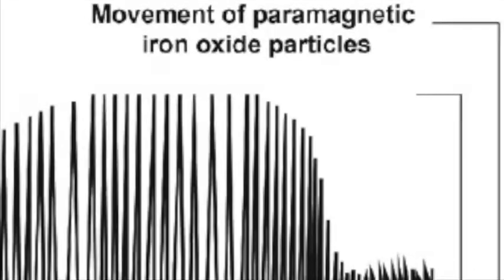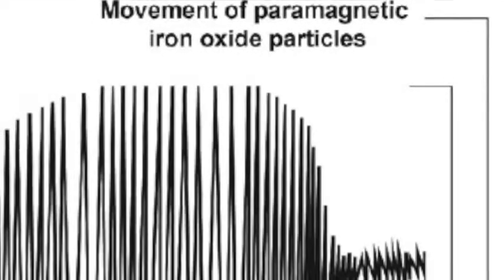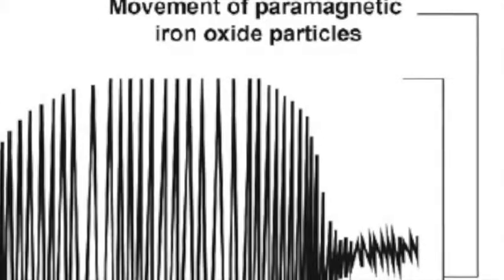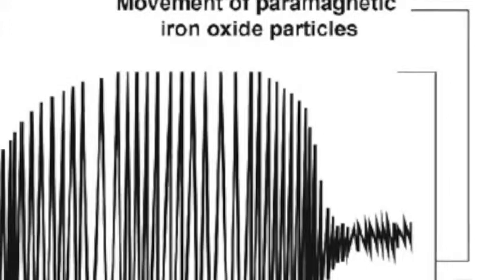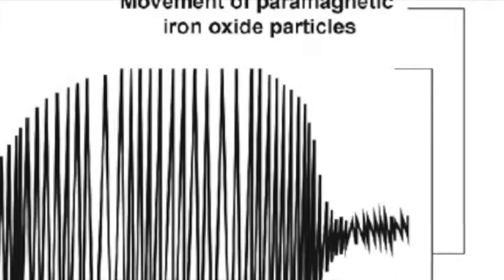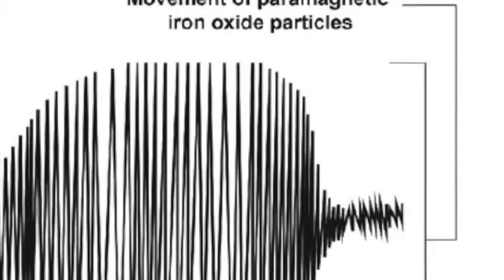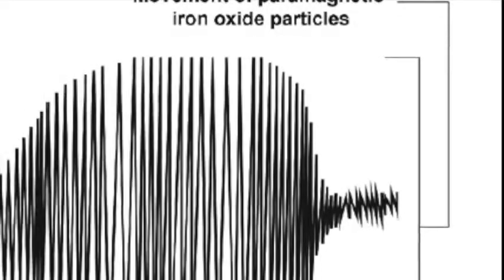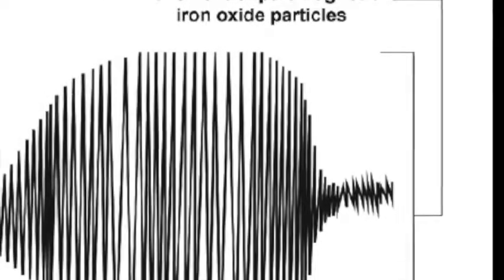The dry hematology system is similar to existing viscoelastic systems. It assesses fibrinogen levels by measuring the rate of thrombin-induced clot formation in a blood sample mingled with paramagnetic iron oxide particles. The sample is placed in an oscillating magnetic field, and the motion of the particles is measured. As a clot forms, particle motion is restricted. The resulting derived values and graphics are superficially similar to the output of a thromboelastograph.